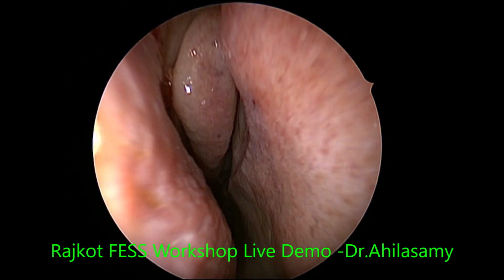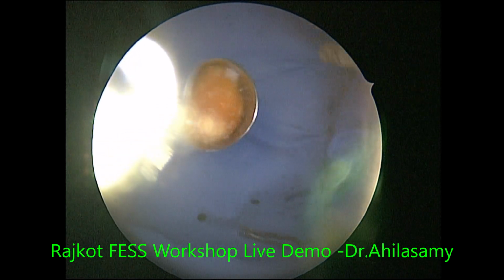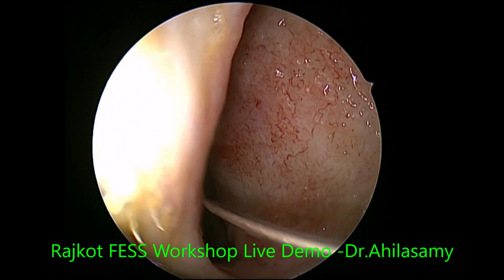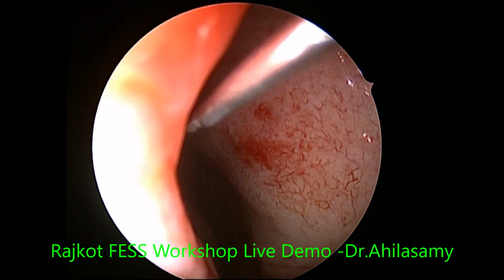So any blood that trickles, you suck it from the choana. Never allow the blood to flow into the choana. If it flows, ask them to swallow it.